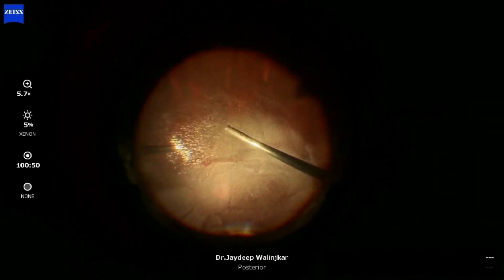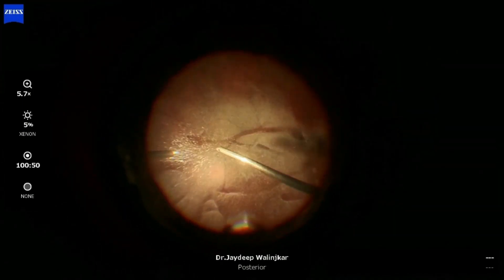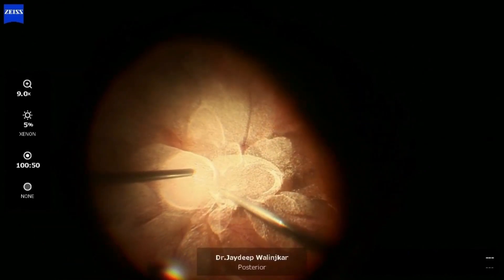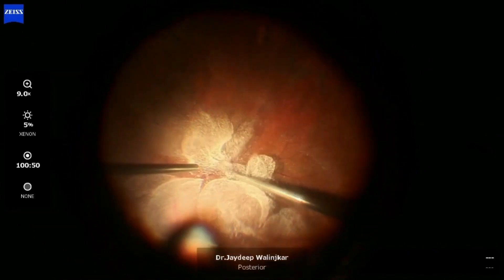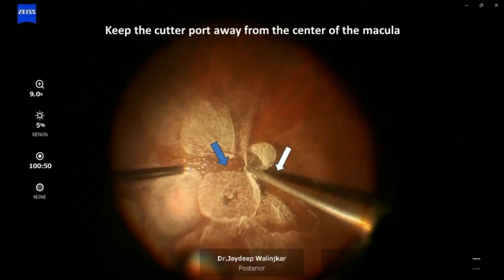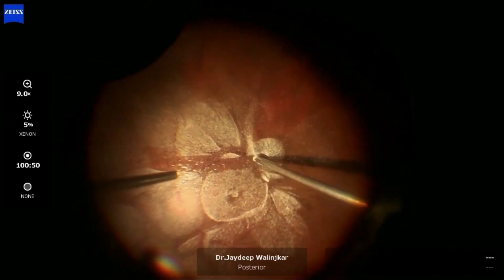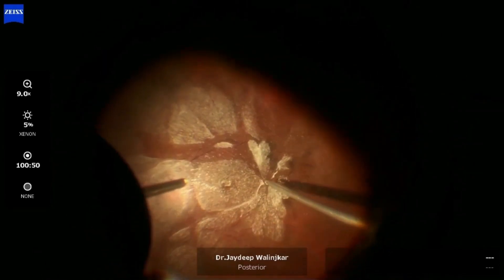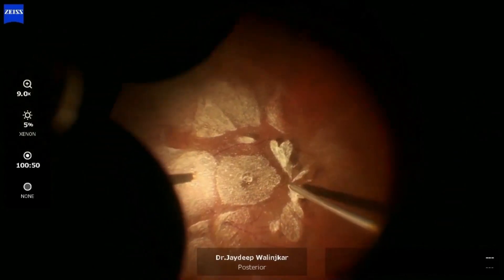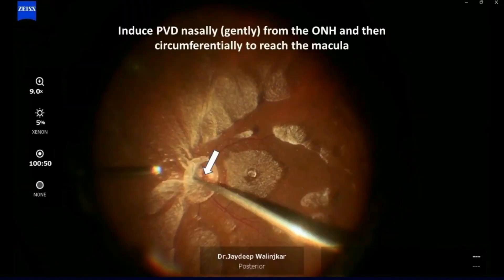After core vitrectomy, triamcinolone was injected to stain the vitreous, and careful dissection of the posterior vitreous was done around the macula to prevent any undue traction at the area of the VMT. The cutter port was always kept away from the center of the macula to prevent traction there. A 360-degree truncation of the vitreous was done to separate all vitreous attachments from the center of the macula and around the optic nerve head.